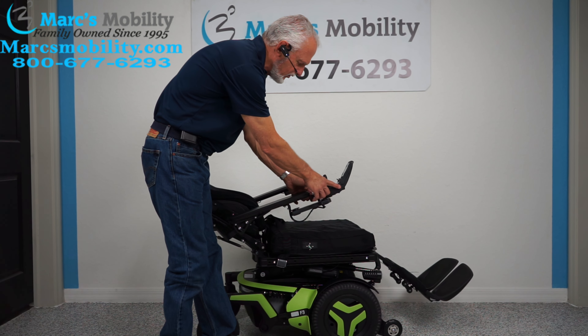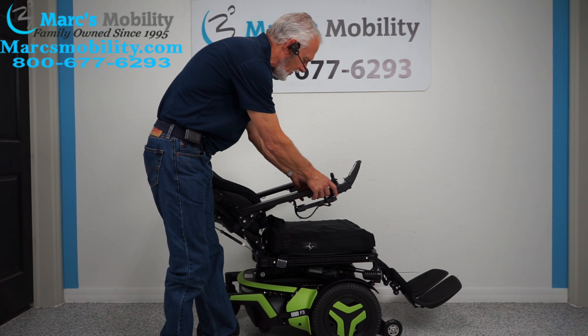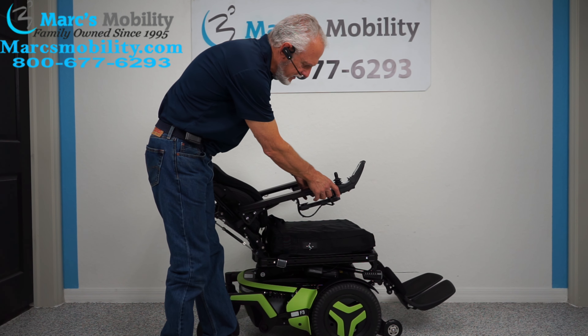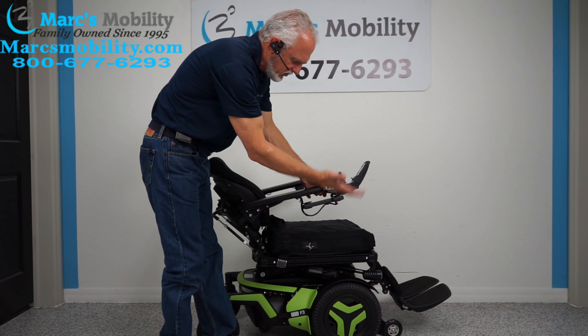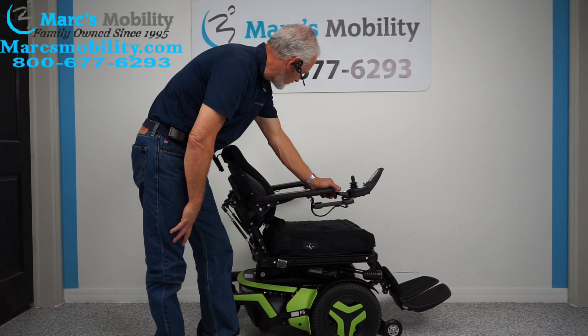If you want to do two functions at once, you can do it through the joystick with a single button. When you're outside, leave your legs out a little bit so you have more room. This one's got plenty of room because the legs are short since whoever had this chair was short.